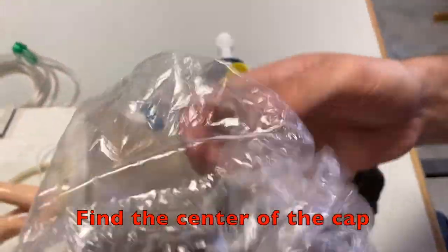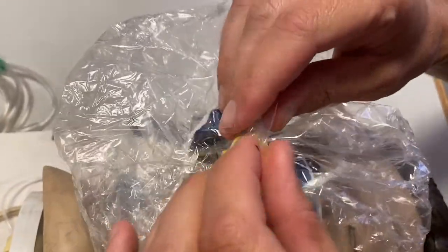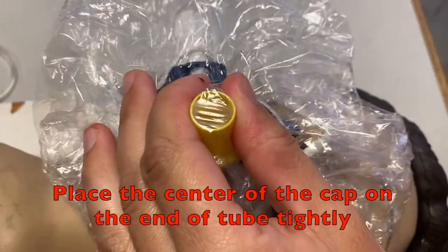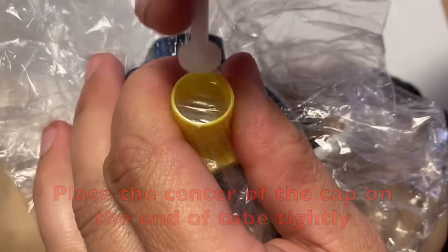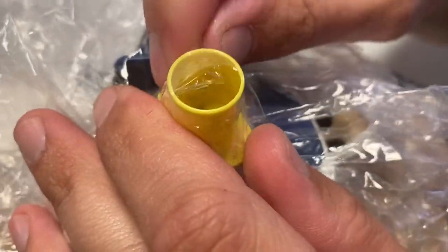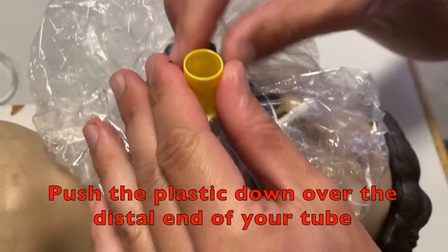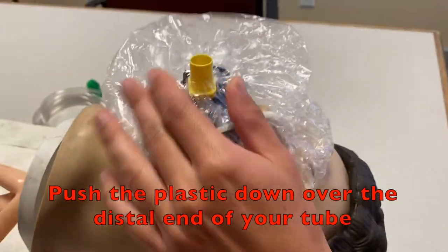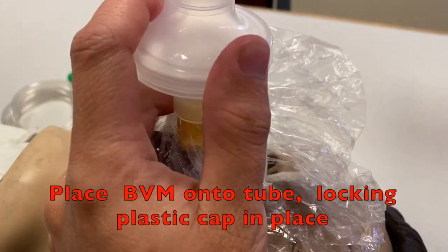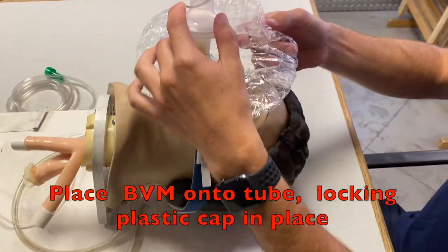Bring that over to the tube that you've placed and place it over the distal end of the tube, and push down on the plastic so it's nice and tight. Once you've done that, go ahead and take something disposable and pop a hole through that — you're going to throw that piece away because it has entered the tube, so you want to make sure it's disposable. Go ahead and put the plastic down around the tube and after that, connect your BVM.